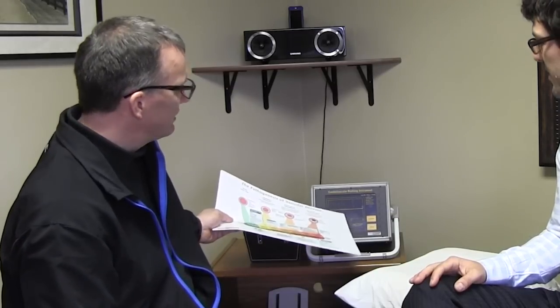So we're actually going to do a test on myself. Yes, and we have Heather. She's my medical assistant, and she's an expert at providing this test. We're going to bring her in here. I'm going to yield my seat so she can work with you. What the test involves is, number one, you can't talk during the test because of the sensor. I failed the test by just saying something, and that was enough to fail the test. So you won't be able to speak during the test. There's an automated blood pressure taking. Heather will find the radial pulse wave, and then it will show up on this monitor right here, the actual pulse wave with the dichrotic notch, and you'll be able to evaluate that. The report will be printed, and we will get our C1 and C2 levels for the large vessels and the small vessels, and we'll know what kind of arterial elasticity you have. It will break it down by age, so we'll know where you are with your age.